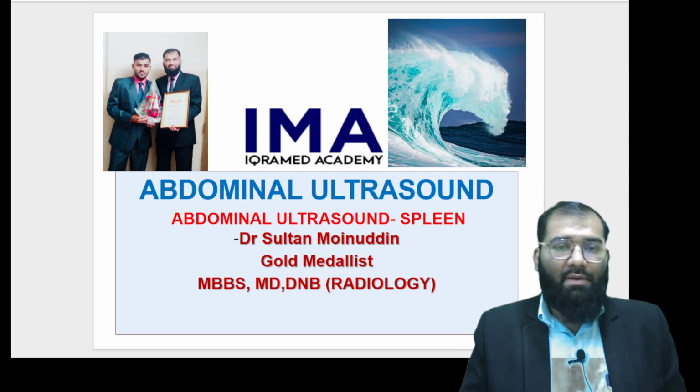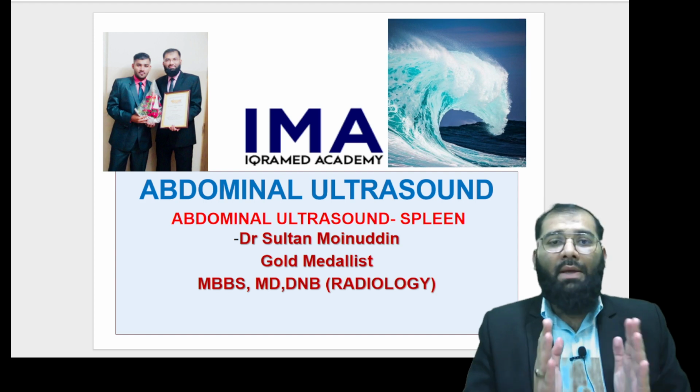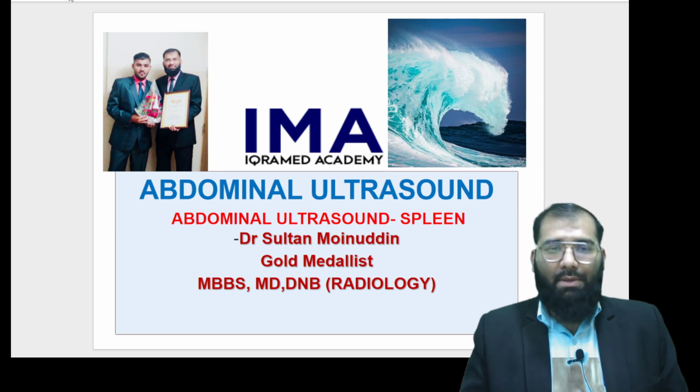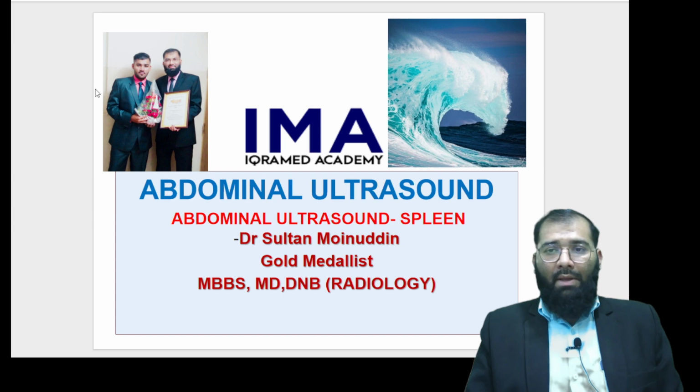In our previous session, we have seen the fundamentals of splenic ultrasound. The probe which we use is the convex probe. We had seen where the spleen is located, the important splenic pathologies, and we also saw how a normal spleen on ultrasound appears. Now in this lecture we are going to see further.